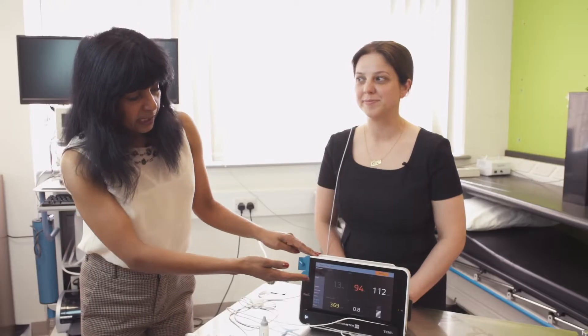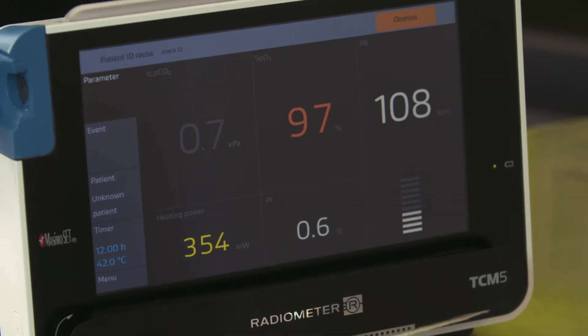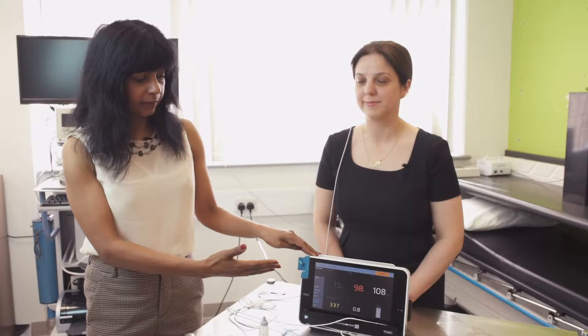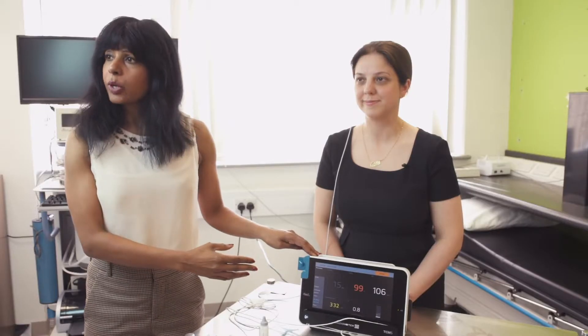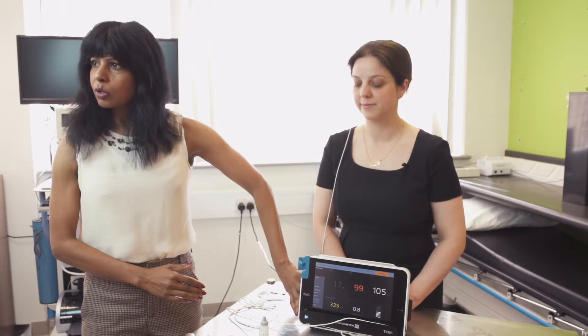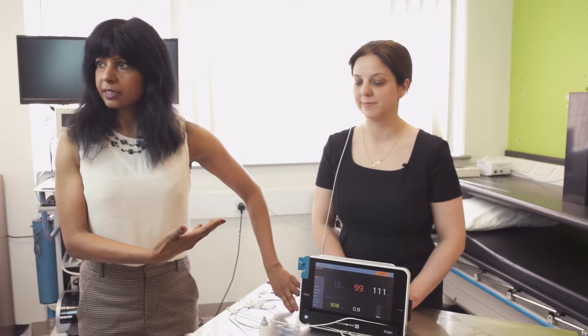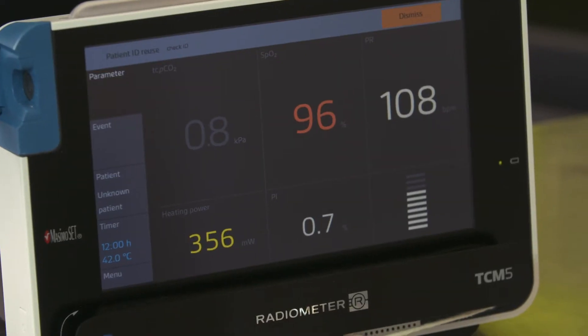You can now see that there are some numbers coming up on the screen as the equipment starts to pick up oxygen and carbon dioxide levels. If at any point the screen goes dark, you just have to very gently dab the on-off button and it will move the machine from standby back into active mode. You are now ready to go to bed.